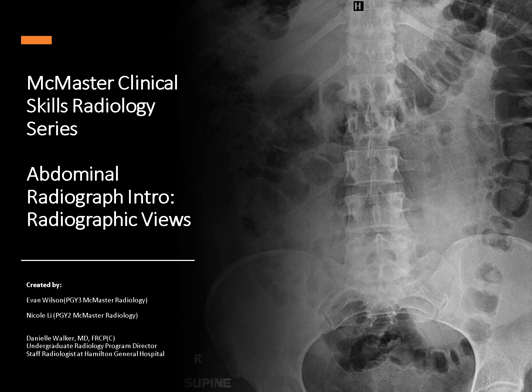I wanted to make this video on abdominal radiograph views, the different views that we acquire when taking an abdominal radiograph. Mostly because I think it's an important concept to go over, but also in the spirit of keeping these videos nice and short, I didn't think that I could go over it at the same time as the video on pathologies. So I just made this short focus video so we can go over this important concept when you're looking at abdominal radiographs.